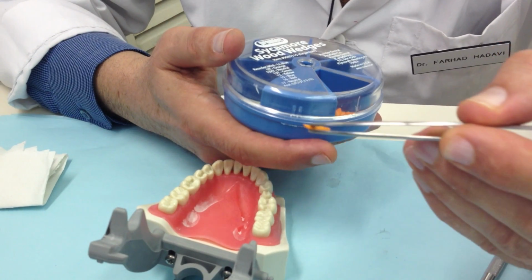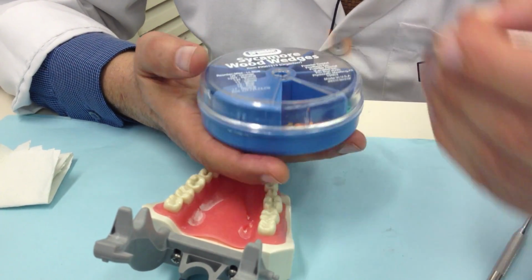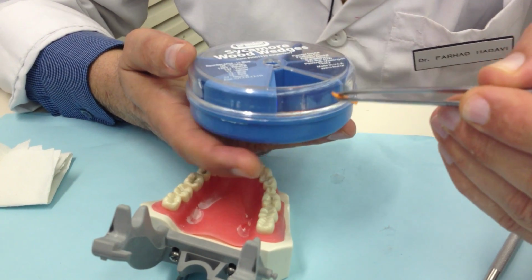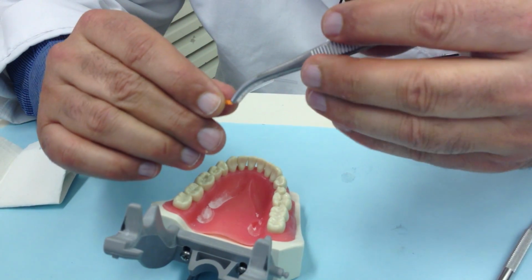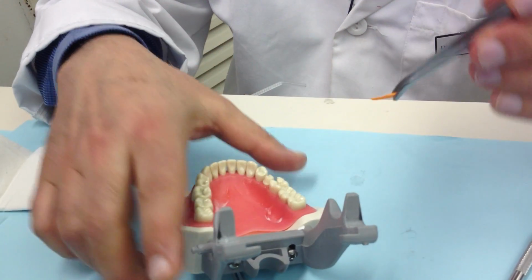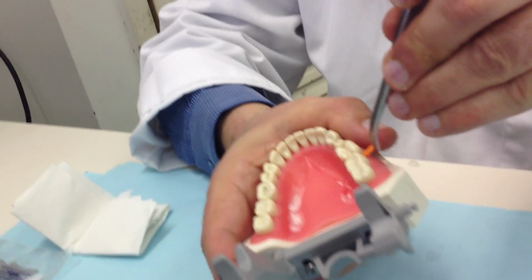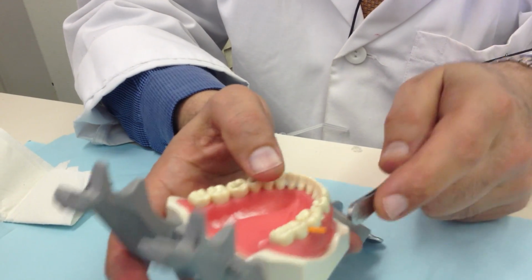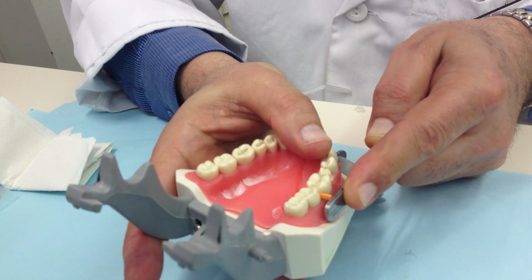First of all, always use your plier if you want to take something from the box, because you are going to use this thing on the patient as well. Am I right? Don't put your hand inside of it. So take a wedge and I try it and see what I get. Now the wedge should be placed base down. Whenever you want to push a wedge in the patient, always get this side of it and push that one through, correct?